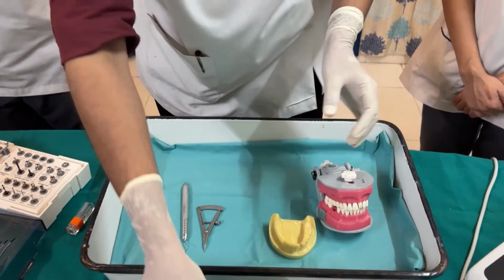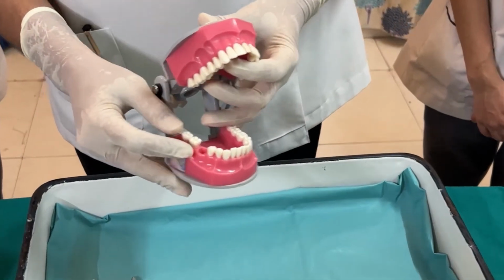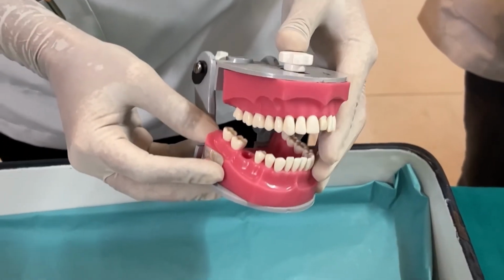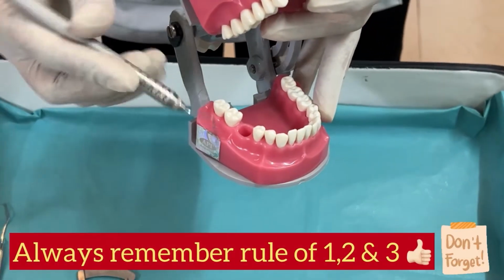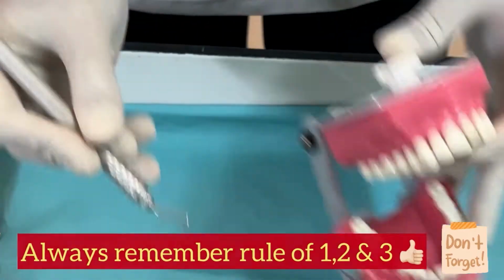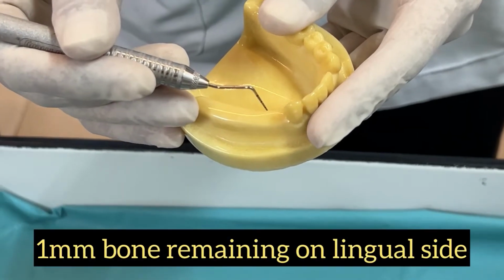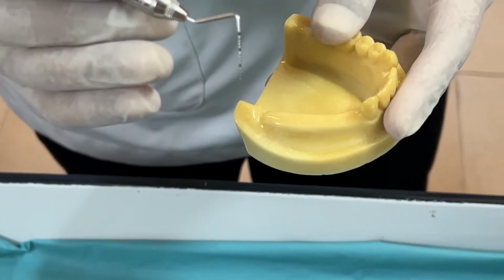Now, suppose I want to place an implant in this area, right? So what I need to do is, based on CBCT, I have to choose a dimension of an implant. Now once I have chosen the dimension of the implant, it should be such that after placement of the implant, ultimately minimum 1 mm of bone should be remaining on the buccal side and 1 mm should be remaining on the lingual side. At least that much of cortical bone thickness should be remaining.